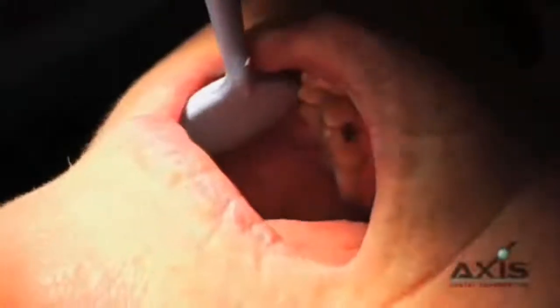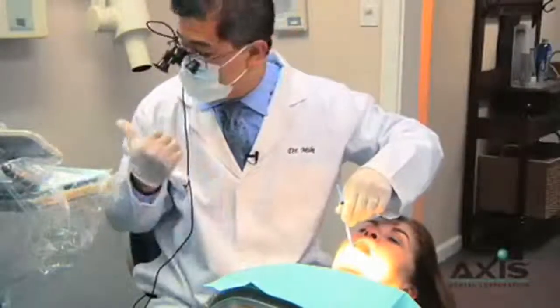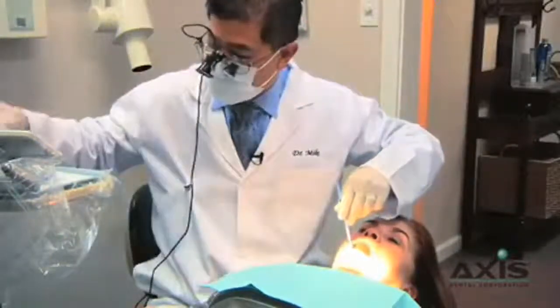One thing I like about this burr kit is I don't mind going back in and adjusting the porcelain, because I can go back in with the Suroglaze Porcelain Polishing System and take it back to its glazed shine.